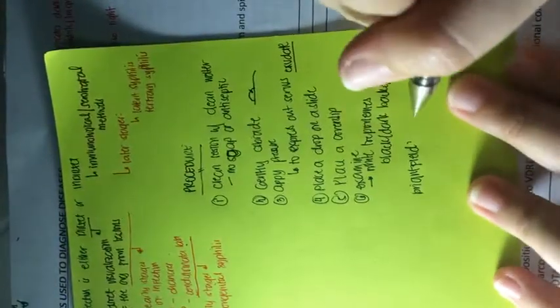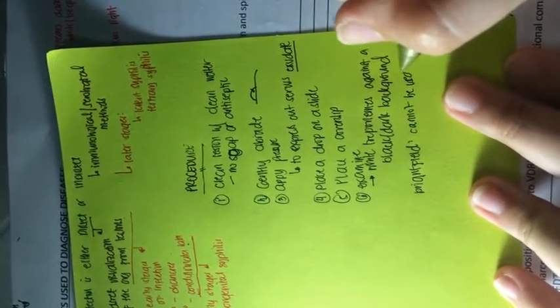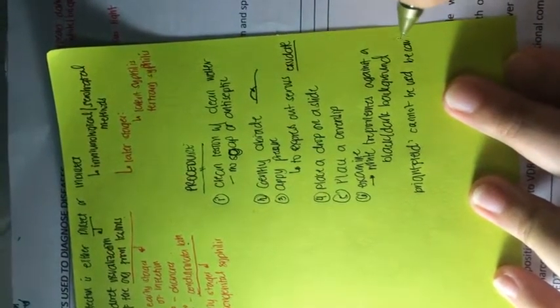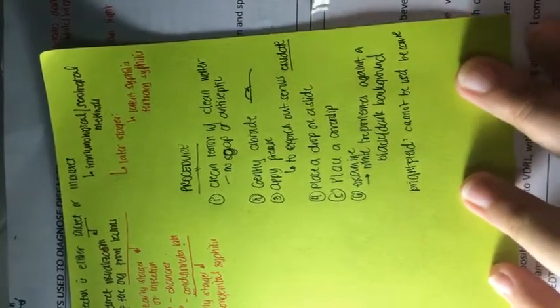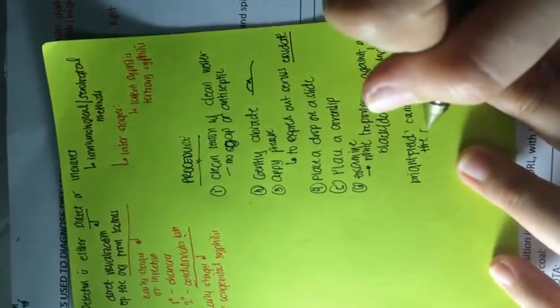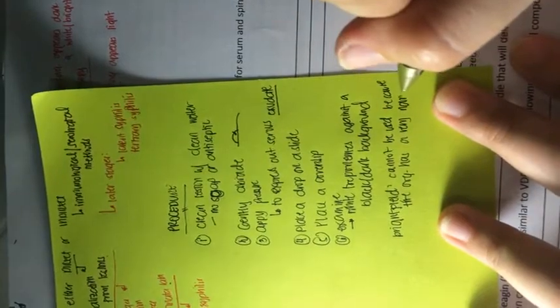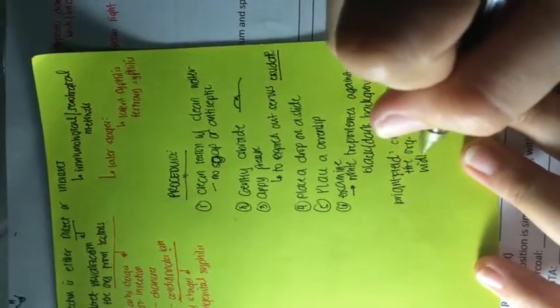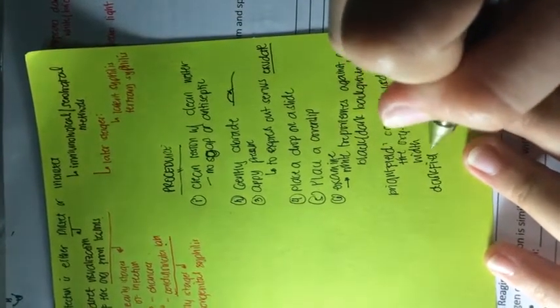Why? Because the organism has a very narrow width. Because of this, dark field microscopy is used.